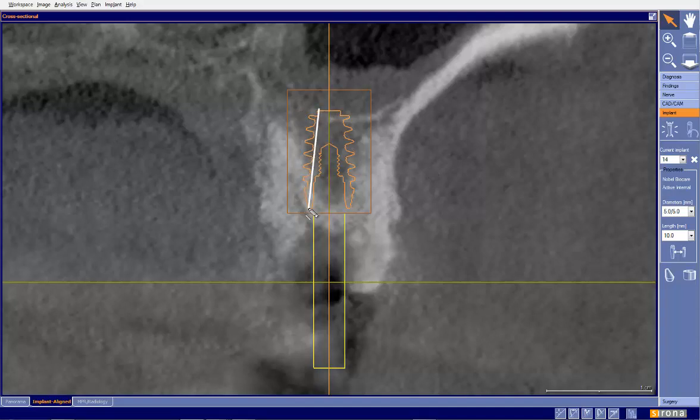Traditional implants may require an osteotomy that's that big, okay? Because that's the inner diameter of the implant. Remember, we're in the posterior maxilla, so we're in softer bone. So the bone will condense, will be able to be condensed.